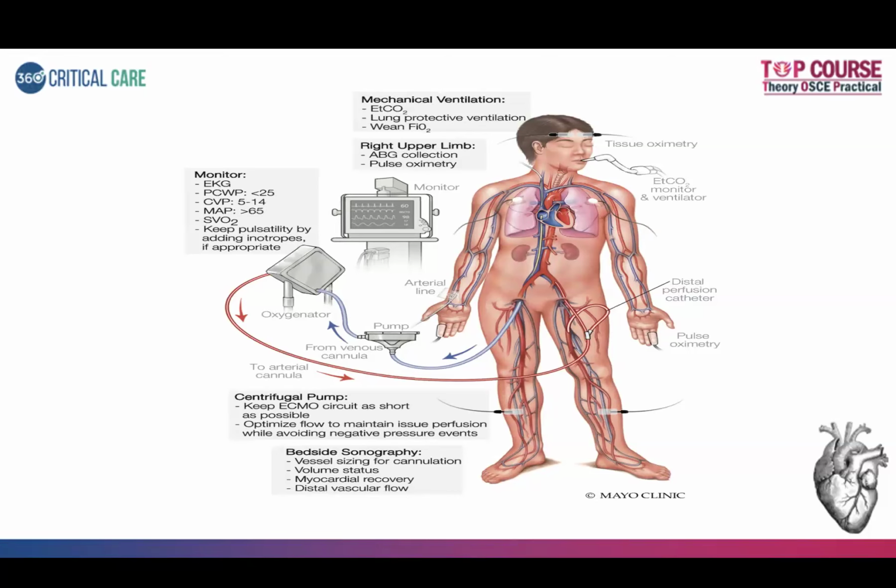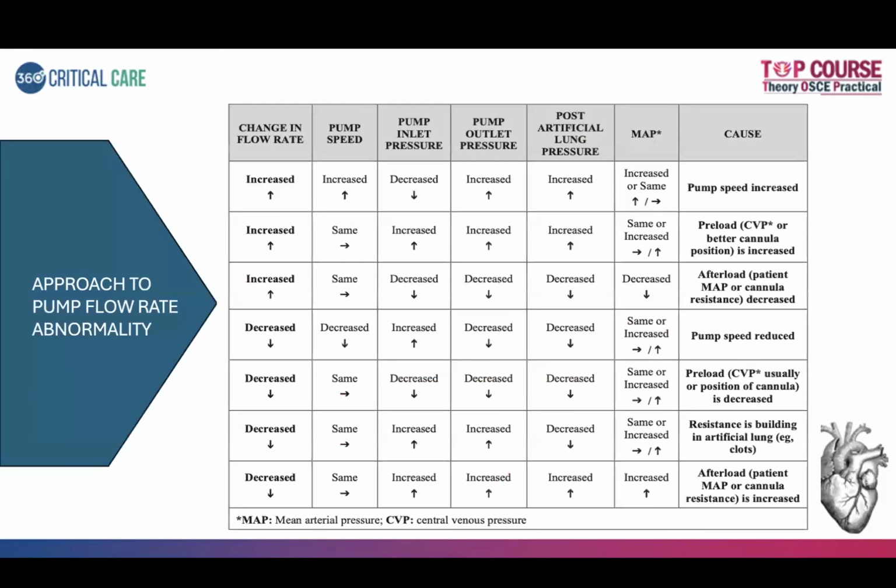So I'm going to the next one. You don't have to read much about this. This is just to show you that if there are pump flow rate abnormalities, there are various ways of troubleshooting it. So you don't have to read about this for now. This is not important from an exam perspective, just to make you aware that there are various ways to approach pump flow rate abnormalities.